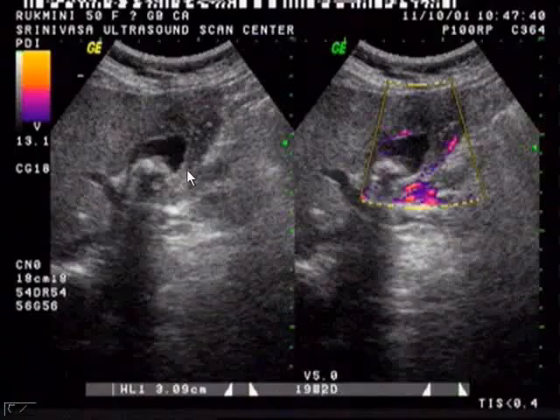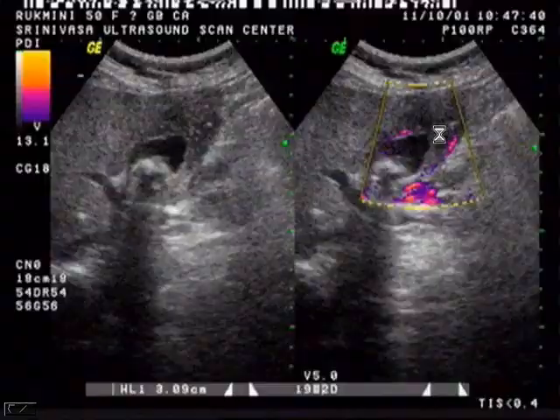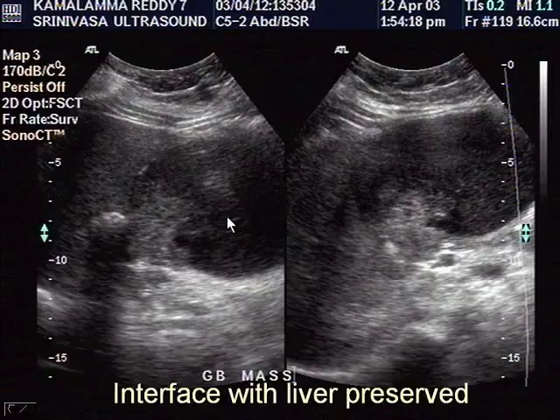On the other hand, let's look at this gallbladder. The neck region looks okay, but the fundic region is grossly thick. Whenever there is a non-diffuse or focal gallbladder wall thickening involving a part of the gallbladder sparing the rest, one must be wary. When I do a color Doppler, there are vascular signals coming up from this thickened area. Again, a gallbladder mass over there. There's a stone, there's a gallbladder mass, and there is an empyema which has developed distal to the carcinoma.